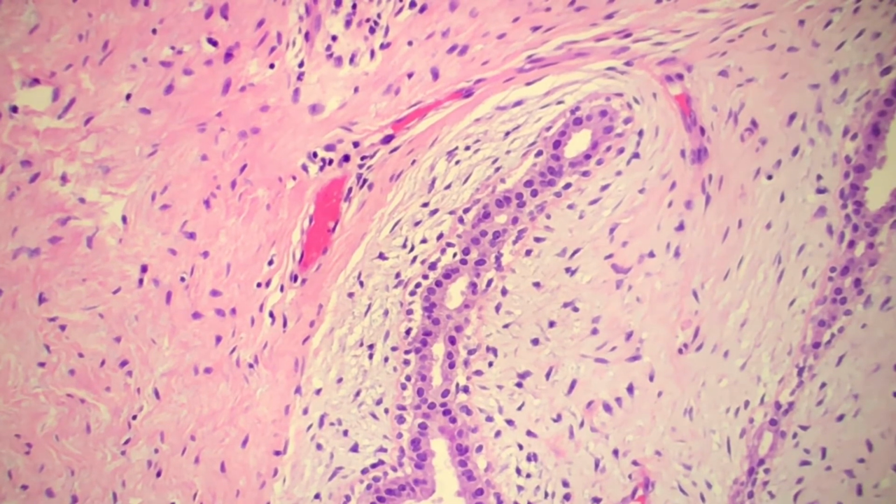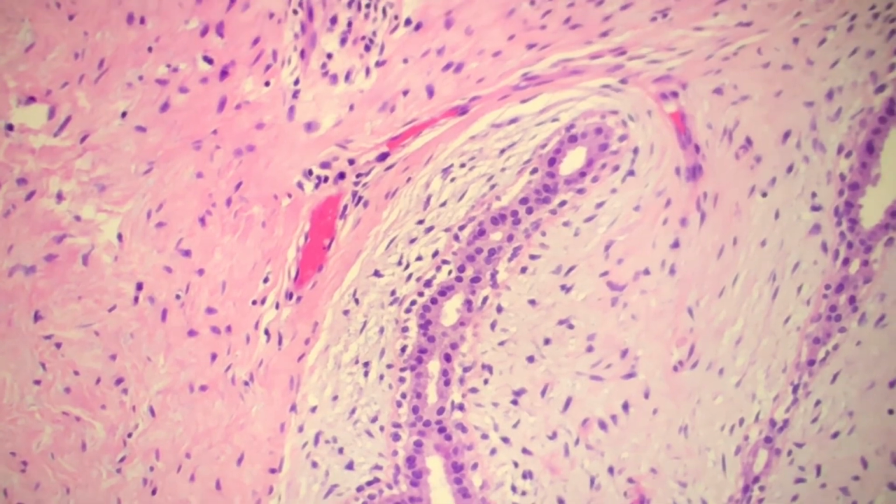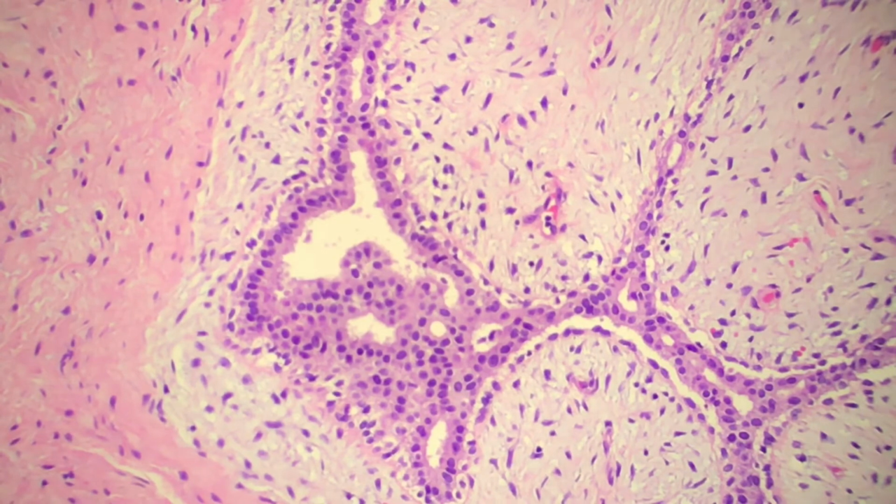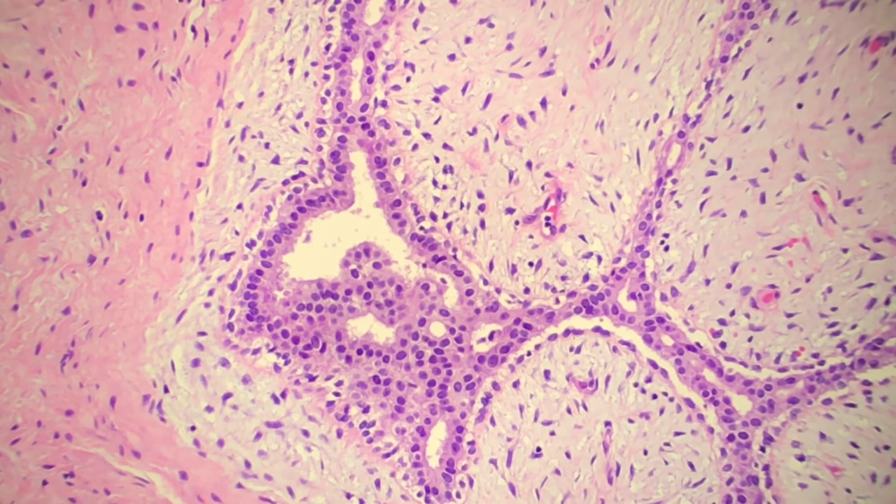For your differential, phyllodes is always going to be at the top of the list. And again, even in this view where it maybe looks a little more leaf-like, with these broad leaf-like areas, there is no cambium layer, there is no increased mitotic activity within the stroma, and the stroma is relatively hypocellular in this case. If you had a cellular fibroadenoma, a good thing to pair with that would be low-grade phyllodes, looking at the differential.